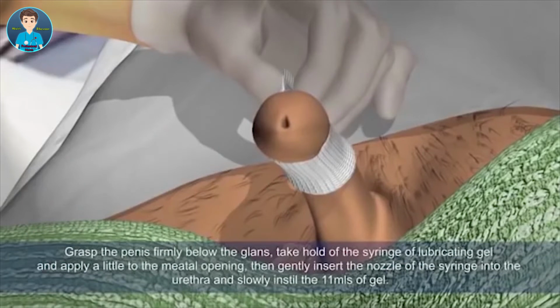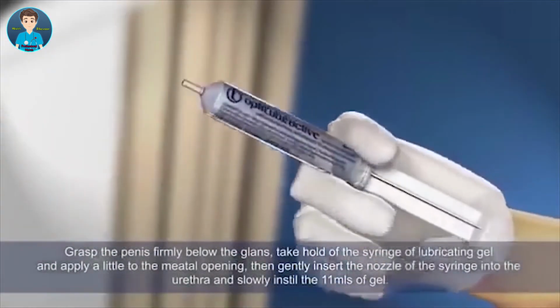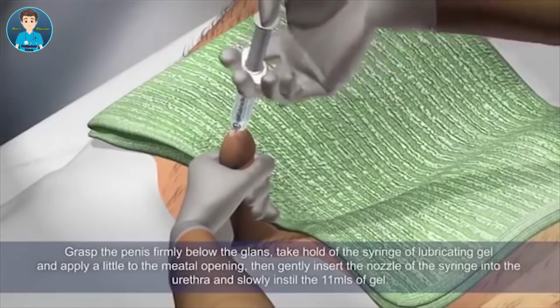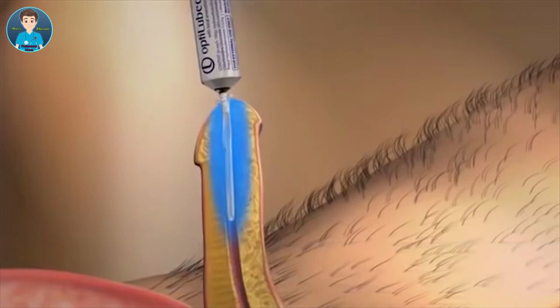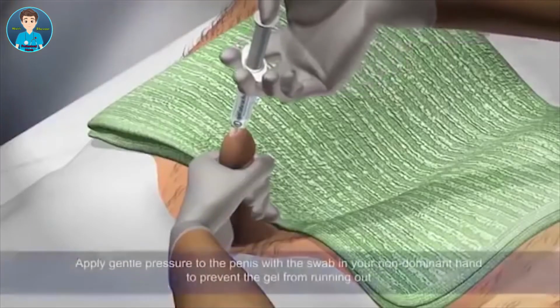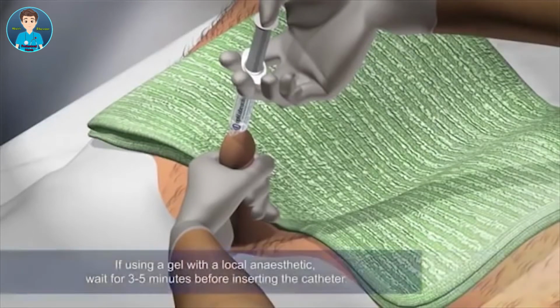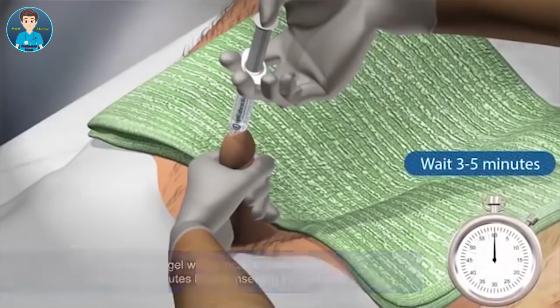Grasp the penis firmly below the glans. Take hold of the syringe of lubricating gel and apply a little to the meatal opening. Then gently insert the nozzle of the syringe into the urethra and slowly instill the 11 mL of gel. Apply gentle pressure to the penis with the swab in your non-dominant hand to prevent the gel from running out. If using a gel with a local anesthetic, wait for 3 to 5 minutes before inserting the catheter.